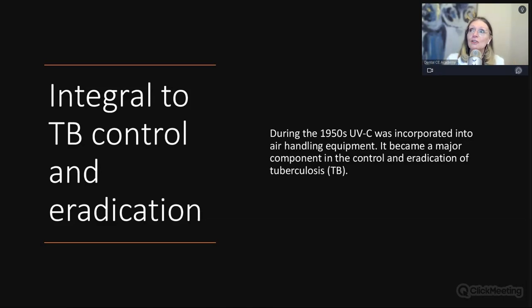And it's interesting when we think about our dental practices and the amount of aerosol that we generate every day, which is a phenomenal amount, and we're immersed in it. It doesn't just go away when we walk out of the operatory. It's still there.